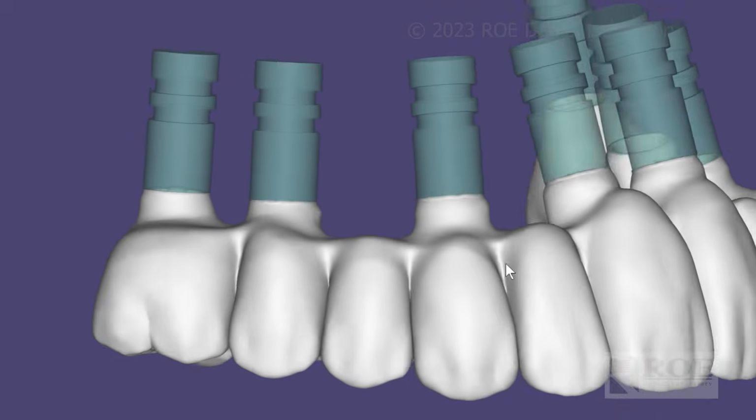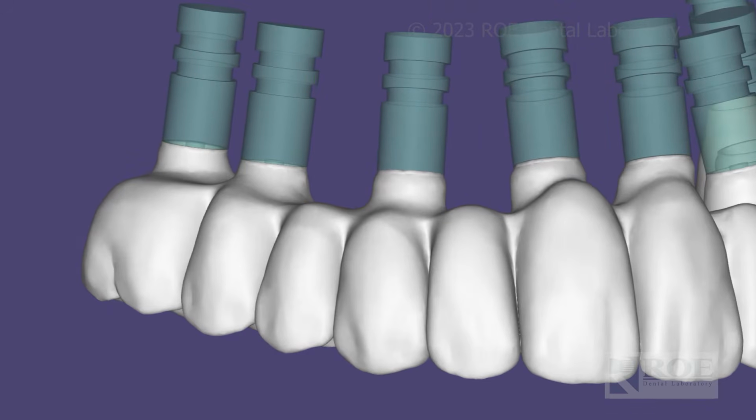Very, very accurate. And we'd like to compare it to photogrammetry because ultimately, photogrammetry is taken at the micron level in the mouth directly from a multi-unit abutment, right? So we know, especially based on their claims and their studies, that it's 10 microns, 15 microns, maybe sometimes a little bit less, but you are talking about 5, 6, 7, 8 implants. So you have that discrepancy when you have multiple implants.